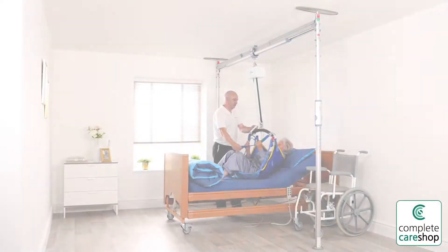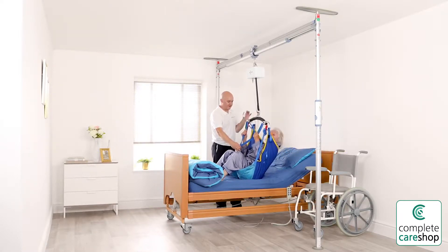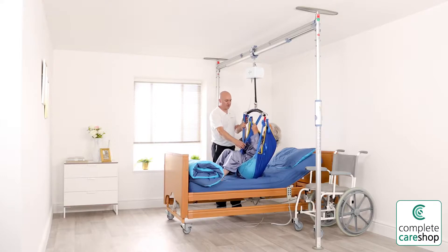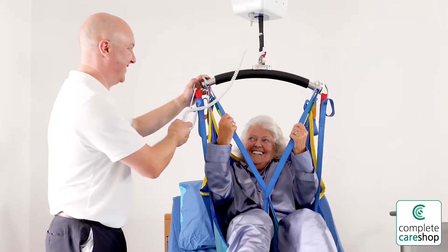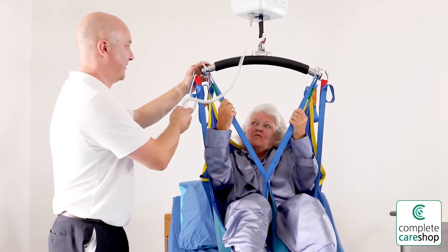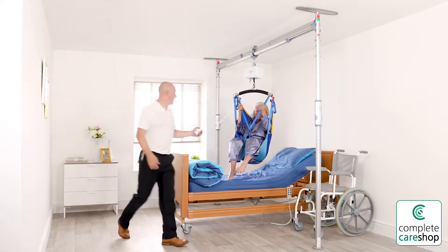The Prism Easy Fit system fits between the floor and a structurally suitable ceiling at a maximum height of 2.1 to 2.8 meters, or 7 to 10 feet, providing a safe, reliable hoist track where a fixed ceiling track is not available. When used in conjunction with a portable track hoist such as a Prism CP 200, the system is perfect for home care, allowing users to extend the time they remain in their own home by years.